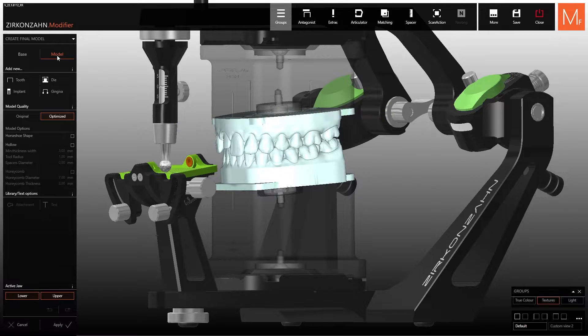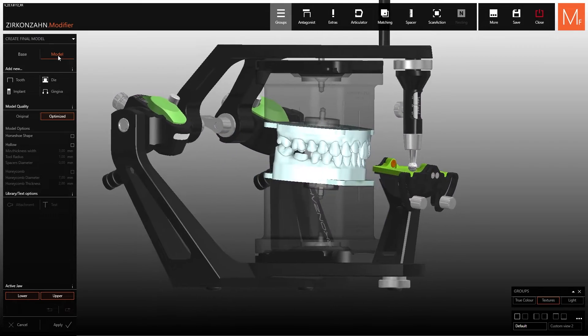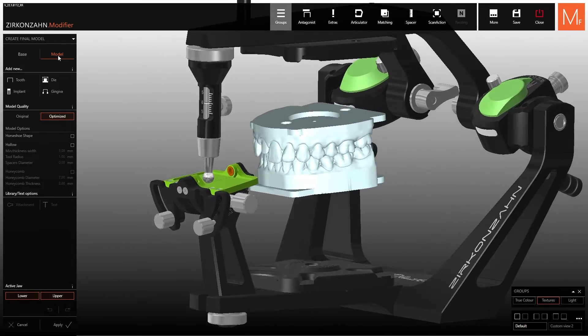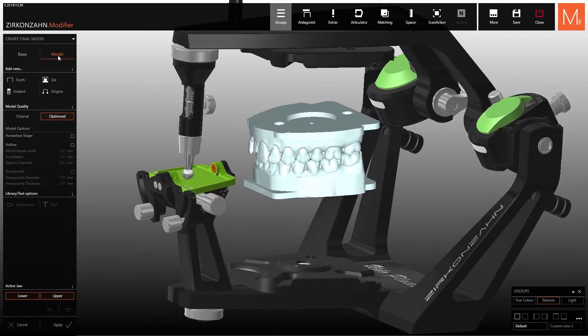As you can see, models are adapted to the jaw aligner bases and provided with the corresponding attachment. A metal plate is then screwed into this attachment in order to magnetically fix the model inside the PS1 articulator for a plaster-free articulation.